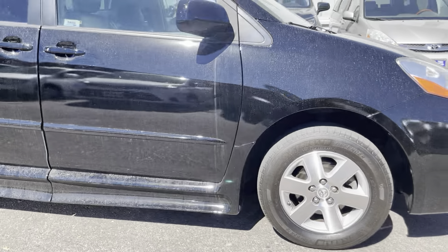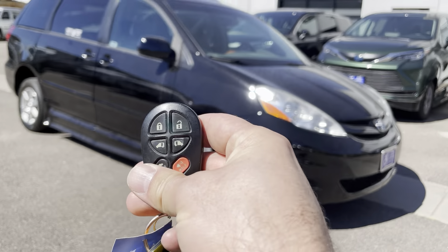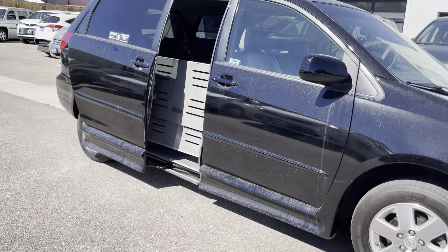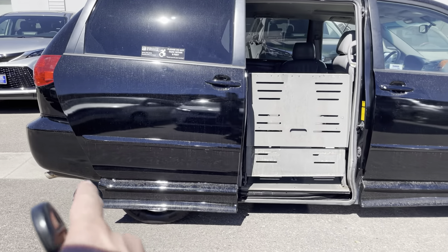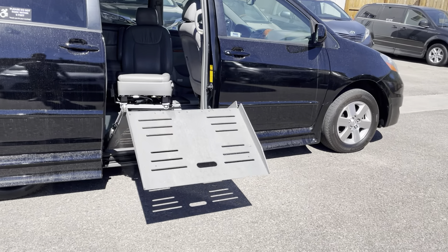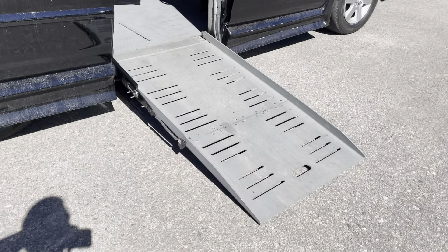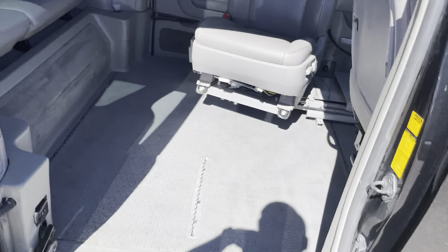Now we'll demonstrate how the Braun Ability system works. With the OEM key fob, make sure it's unlocked, then give a good 2.5-second press on the passenger side slider door button. That's going to activate the ramp sequence: the door opens, it kneels down, and then the ramp comes out. Those three things are all done with the press of one button — it's a fully integrated system. You've got a 9-degree ramp angle, so manual or power chairs are able to get up into the car fairly easily.